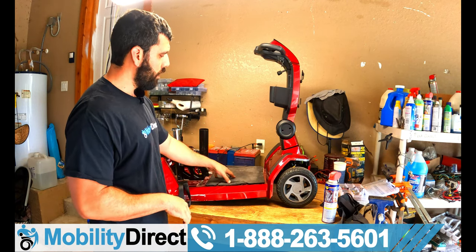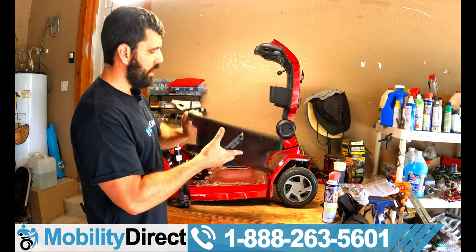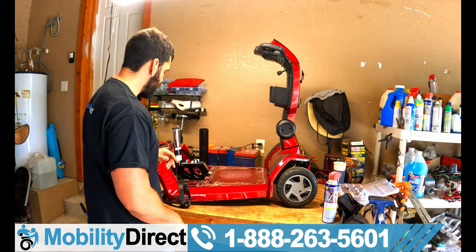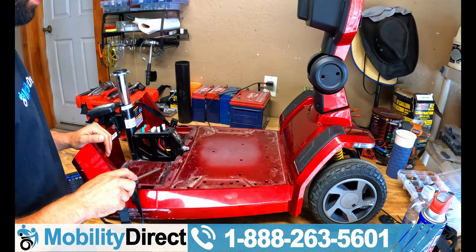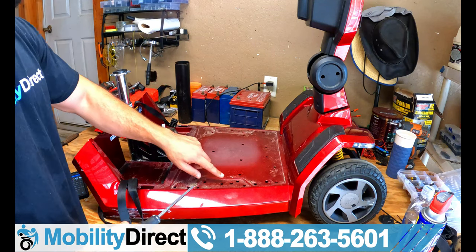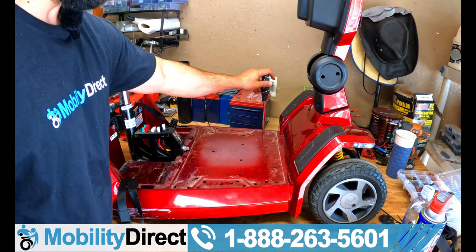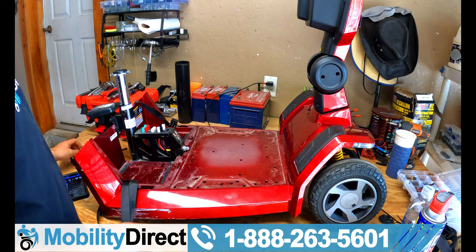Peel back these little rubber mats first — they pop out, just takes a little strength. Then you need to take out a total of 10 screws with a Phillips head screwdriver. The first three screws are on the right side battery compartment, then three on the left side battery compartment, plus four more for a total of 10. I've already loosened them. Once all 10 are out, you can begin to lift out the plate. Make sure your battery strap is completely loose before lifting.